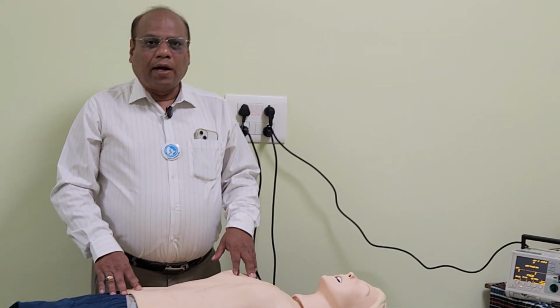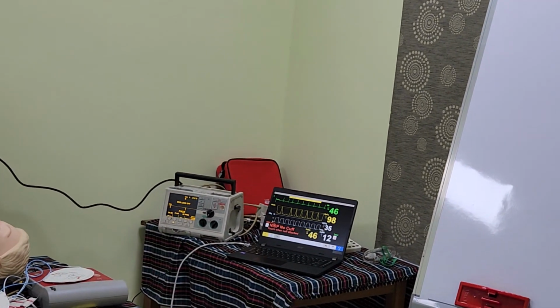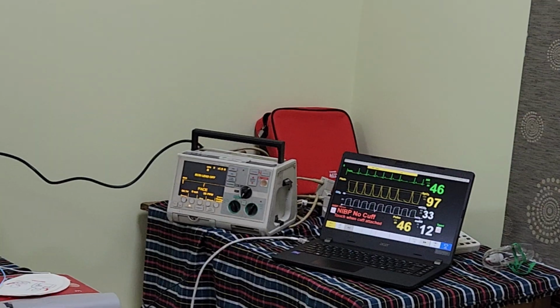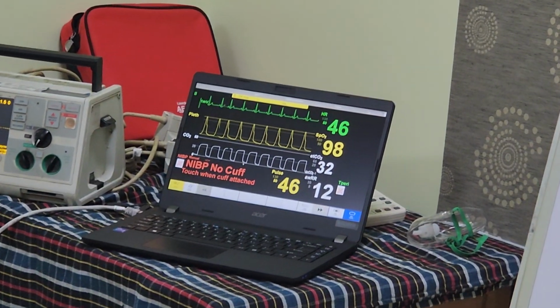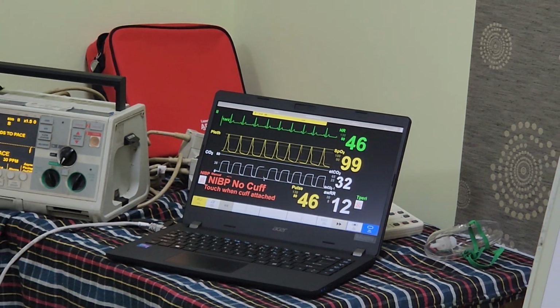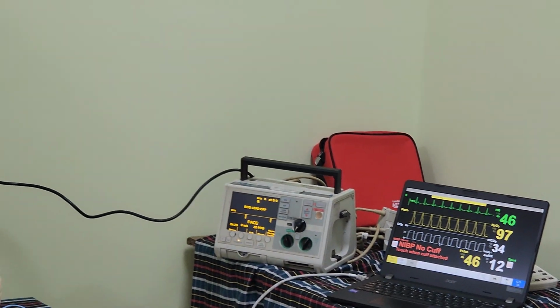Initially, the instructor needs to show a bradycardia algorithm which may require transcutaneous pacing. The scenario has to be created by the instructor and the student needs to perform. So here I have shown a bradycardia scenario, which is a case of sinus bradycardia, and the student needs to be first told how to approach a case of sinus bradycardia with the pharmacological maneuver, and once the pharmacological maneuver fails, the second line of treatment is transcutaneous pacing.